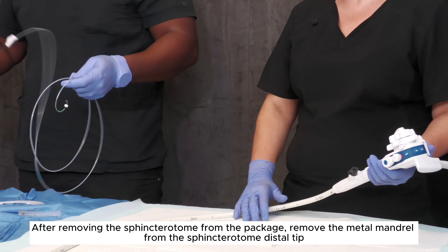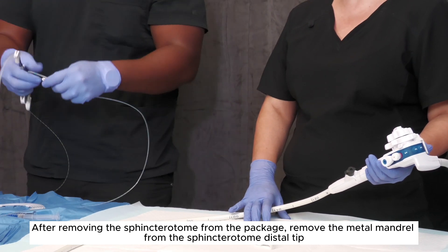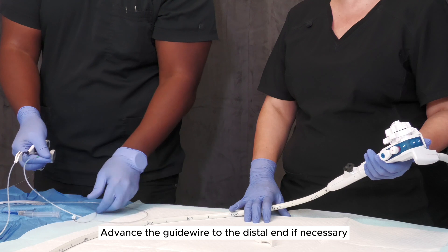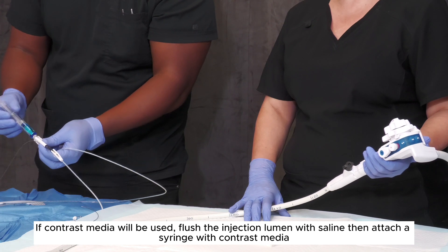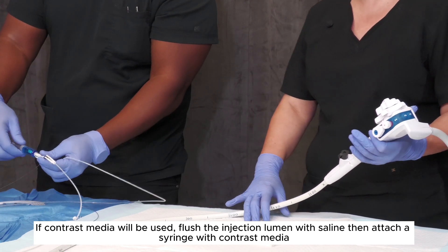After removing the sphincteratome from the package, remove the metal mandrel from the sphincteratome distal tip. Advance the guide wire to the distal end if necessary. If contrast media will be used, flush the injection lumen with saline then attach a syringe with contrast media.